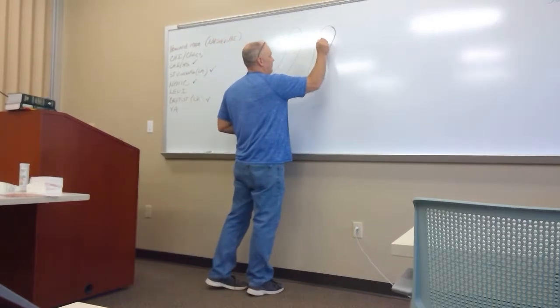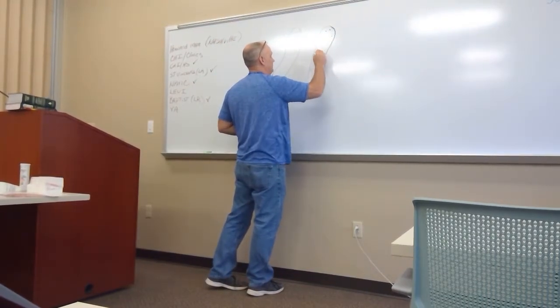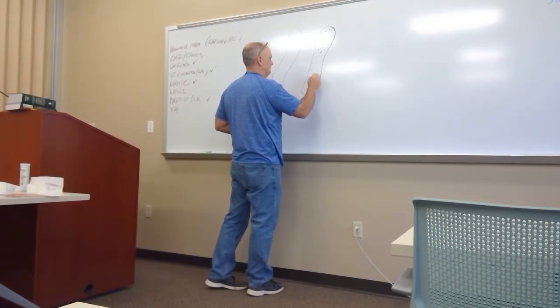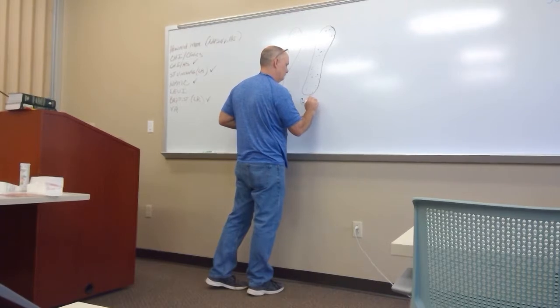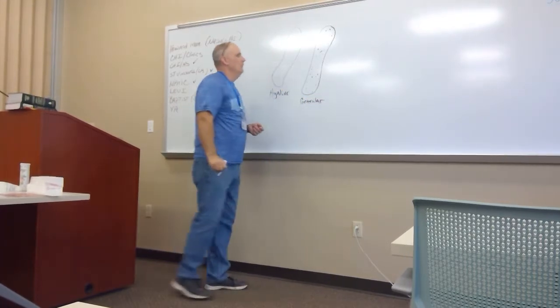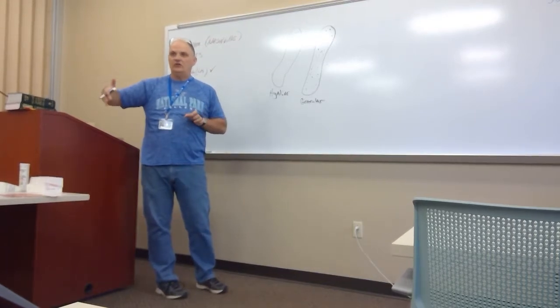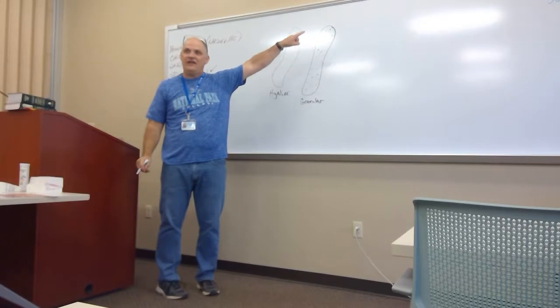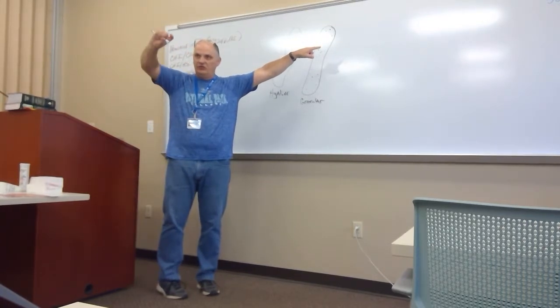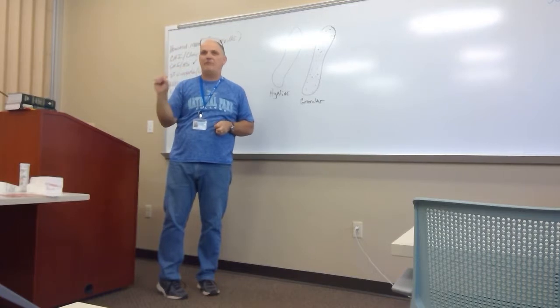The next one, and they think that this is caused from cellular breakdown, is a cast that's called a granular cast. It'll have little granules in it. They claim that these granules may be the disintegration of what was a cellular cast. Sometimes in that little matrix that I told you forms at the distal convoluted tubule, cells get trapped in that.